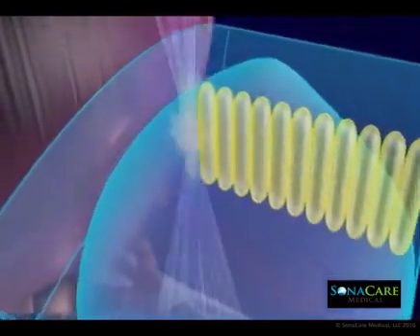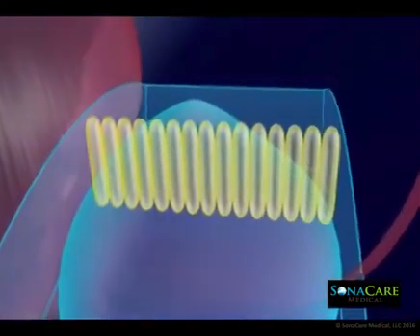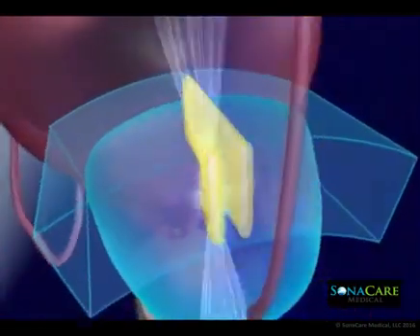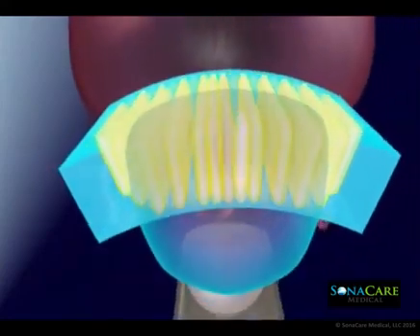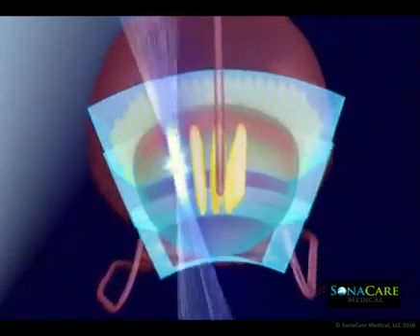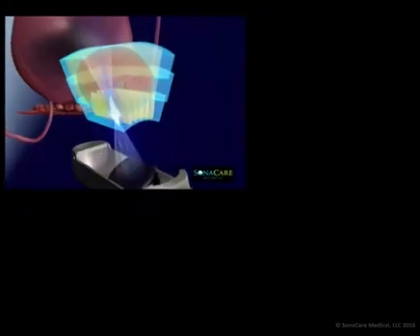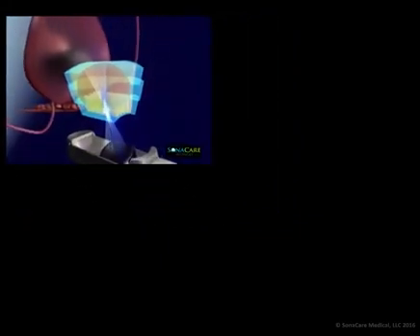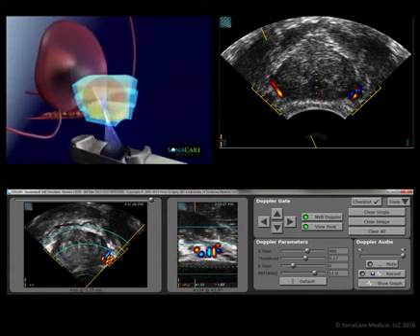Every ablation lesion is specifically planned around the identification of critical anatomical structures such as the prostate capsule, seminal vesicles, rectal wall, and neurovascular bundles. HIFU is non-surgical and radiation free, with each lesion being comparable in size to a grain of rice. The on-screen simulation represents a whole gland ablation.